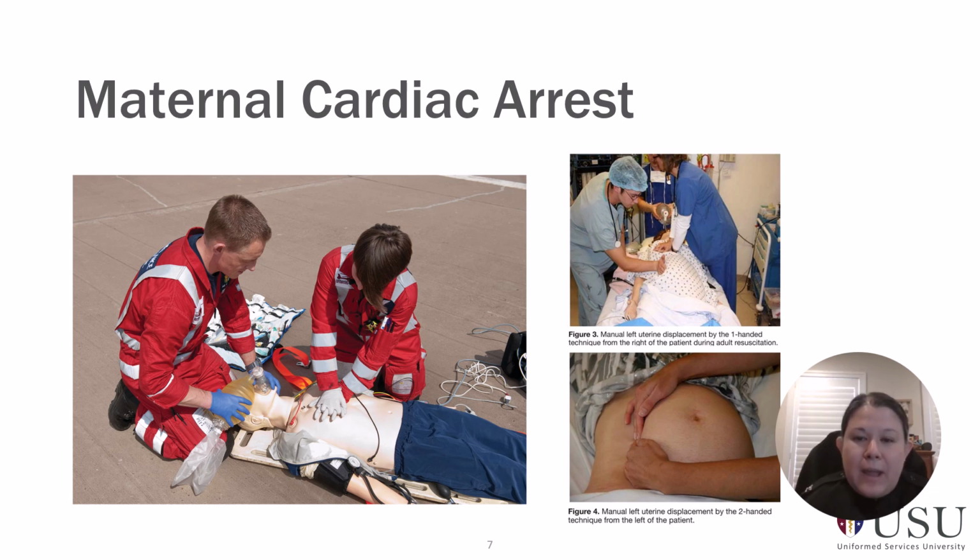So you can very rapidly see if you don't displace the uterus correctly during cardiac arrest, you're probably very ineffective in your chest compressions. And so this is actually a skill that requires not only an additional team member, but coordination for effective accomplishment of successful maternal resuscitation. And so here's an example of two resuscitators providing CPR for a patient. You would essentially need at least a third person to displace the uterus and then probably a fourth person to effectively carry out a resuscitative cesarean delivery or peripartum cesarean delivery.